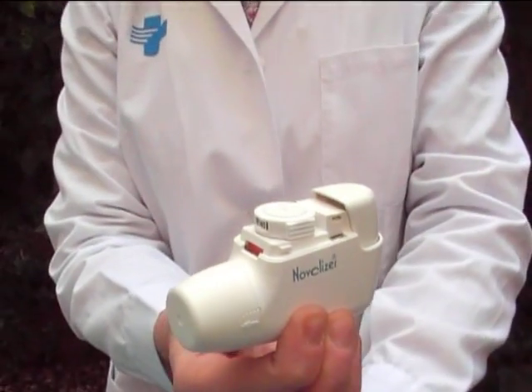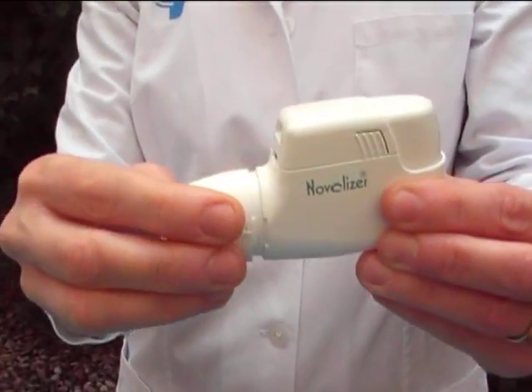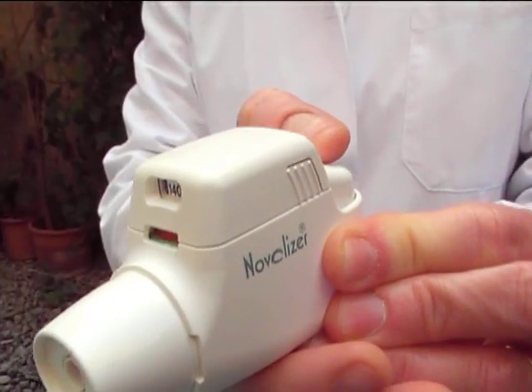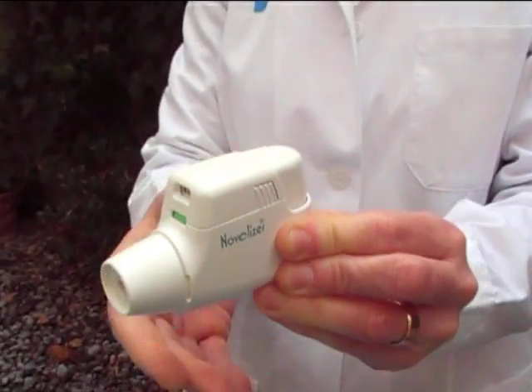Put the top back to its place. Take the cap off. Load the inhaler by pressing the button at the back and you will see that the window will change color from red to green. It's now ready for use.